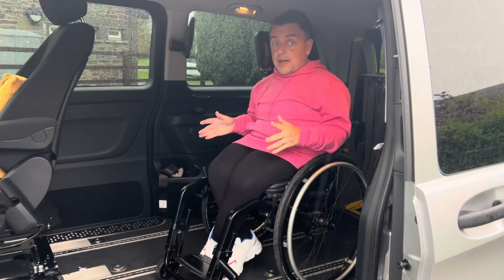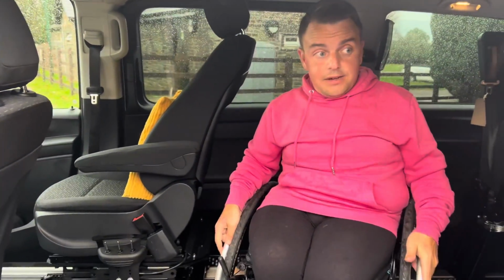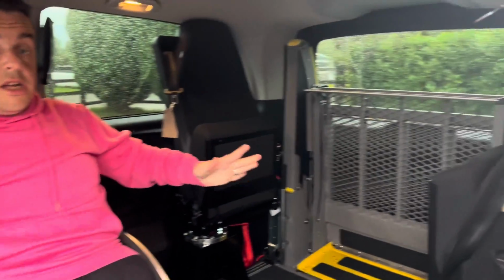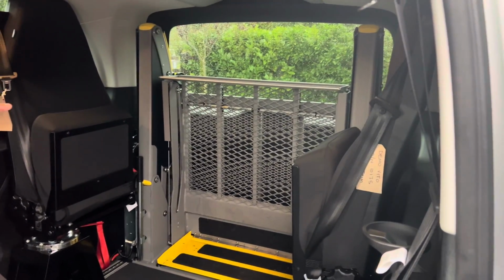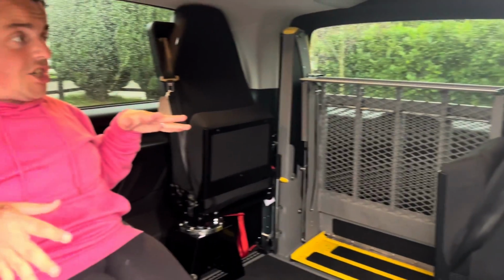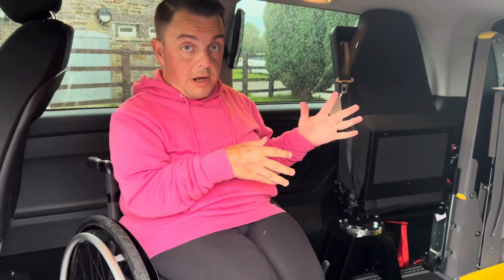So we're inside the van. Now then, first thing I want to show you is the back of the van, and in the back you'll see there are two fold-away seats. Now there are different seating configurations available, but it all depends on what entry you want, whether you want the side entry or the boot one.